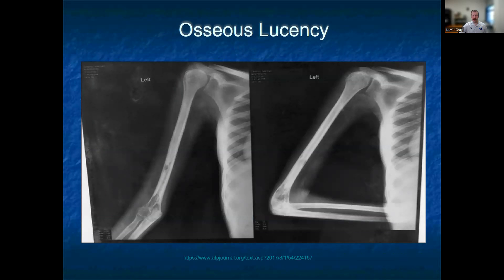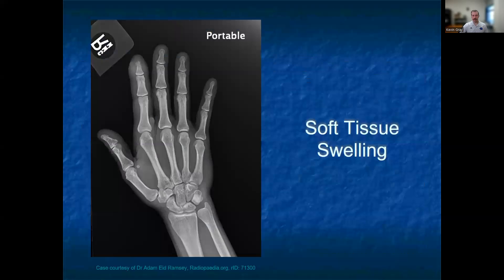We can see osseous lucency as seen in this humerus image, with a couple of different areas where there is decreased osseous signal in an area where we would expect to have more calcification. Occasionally, you will also just see findings of soft tissue swelling as seen in the second digit here, without any other abnormal radiographic findings.